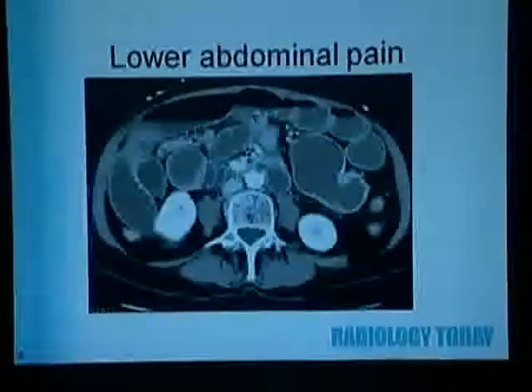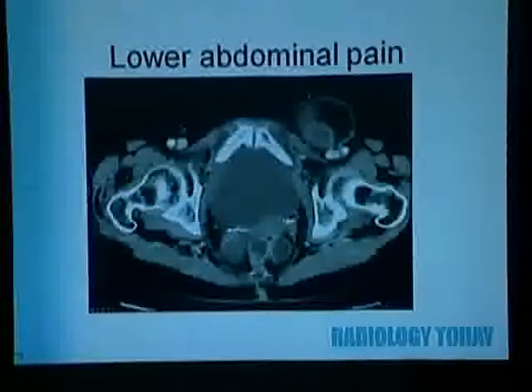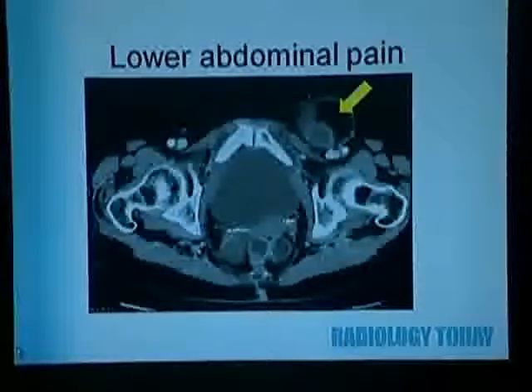And because I've had more, in my limited time being a radiologist, more than a handful of times where it turns out to be an occult perforated colon cancer, especially when we don't see any adjacent diverticuli or a causative etiology. CT is excellent for looking at small bowel, particularly small bowel obstruction, as is this case. We can look for the transition point and delineate a small bowel obstruction from an ileus. In this particular case, it was a left inguinal hernia, which was resulting in the obstruction.